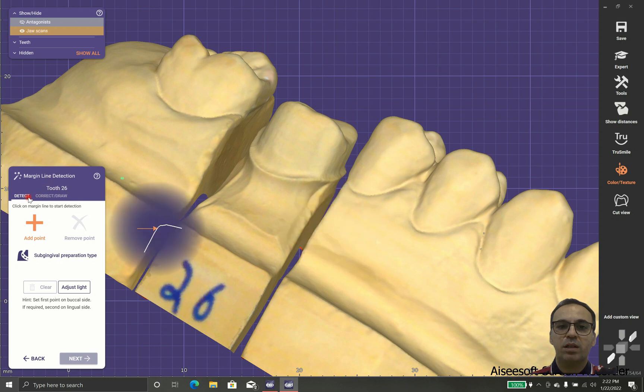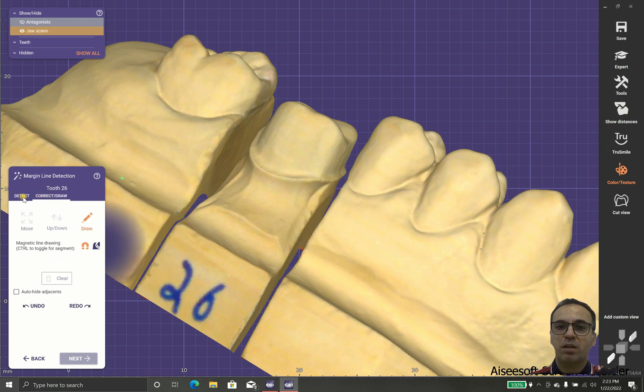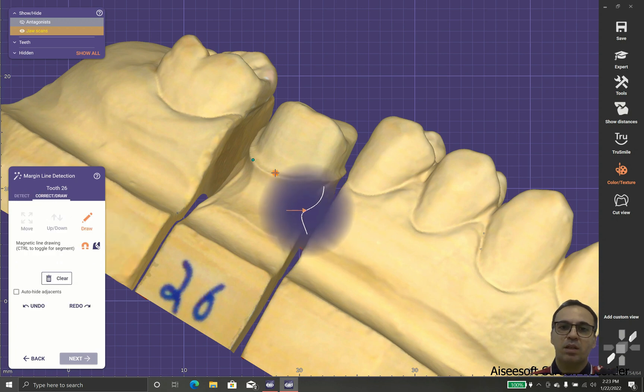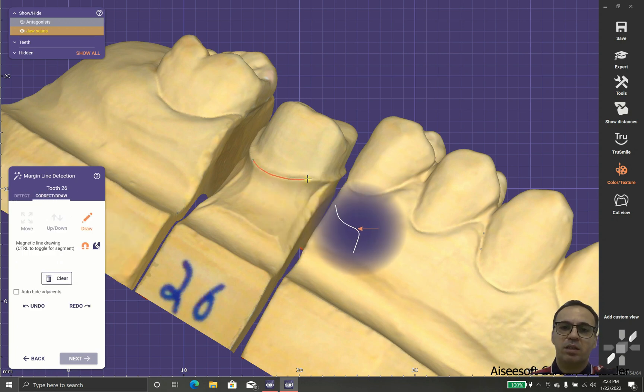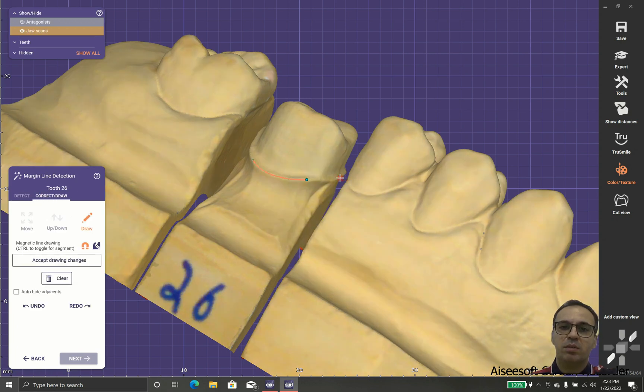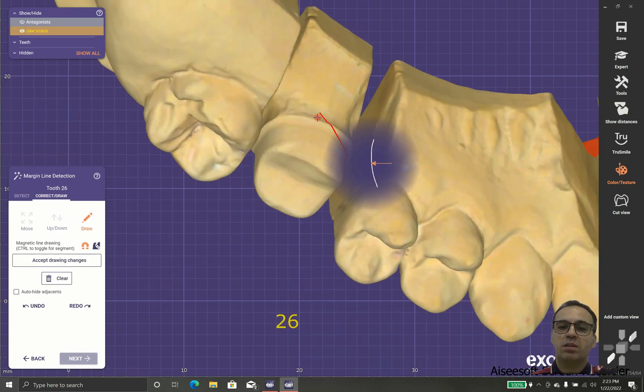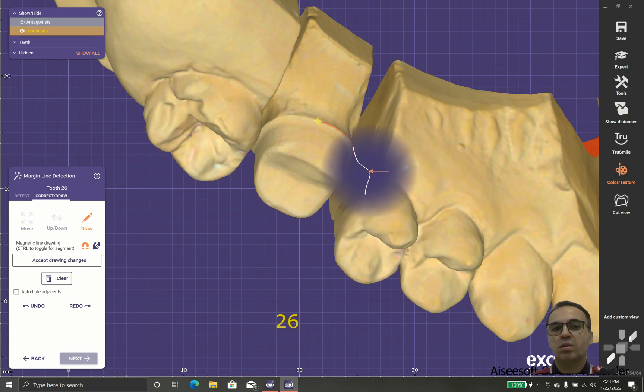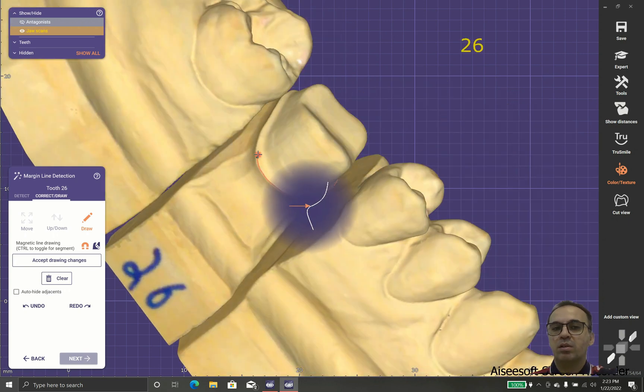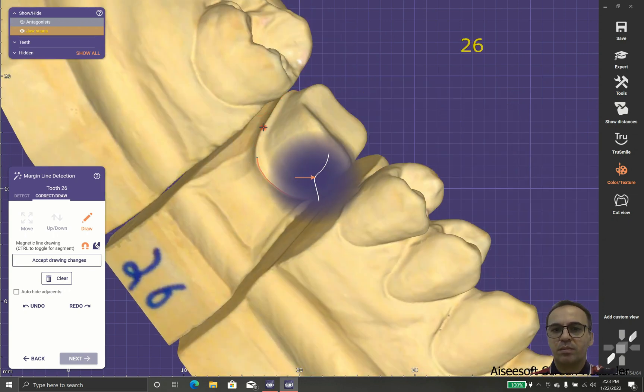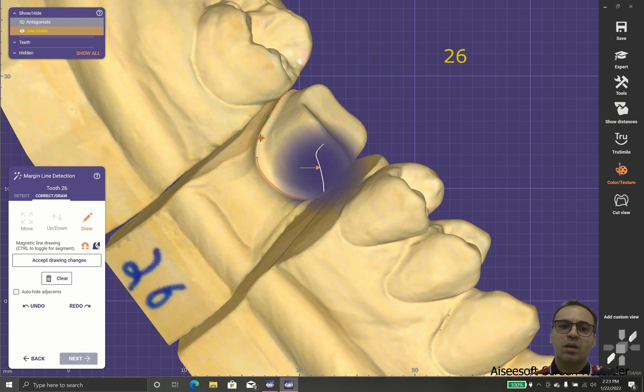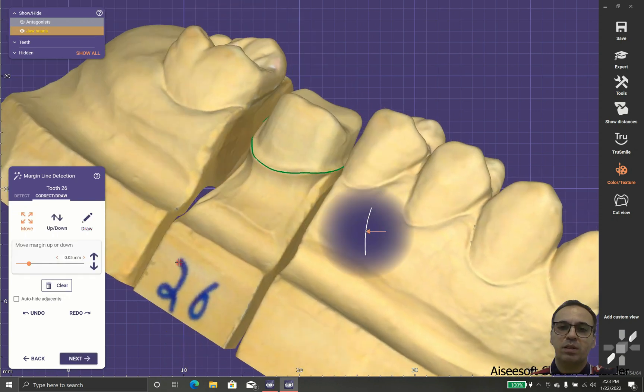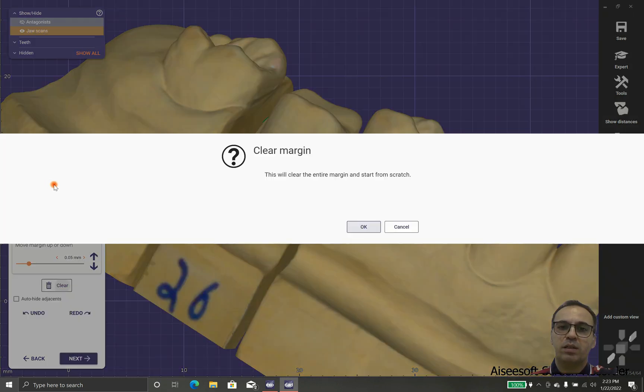At this part we could show the margin to the software with detect or correct and draw. Detect: you point one point or sometimes four points on the margin. But in correct and draw you will help software to find the margins step by step.